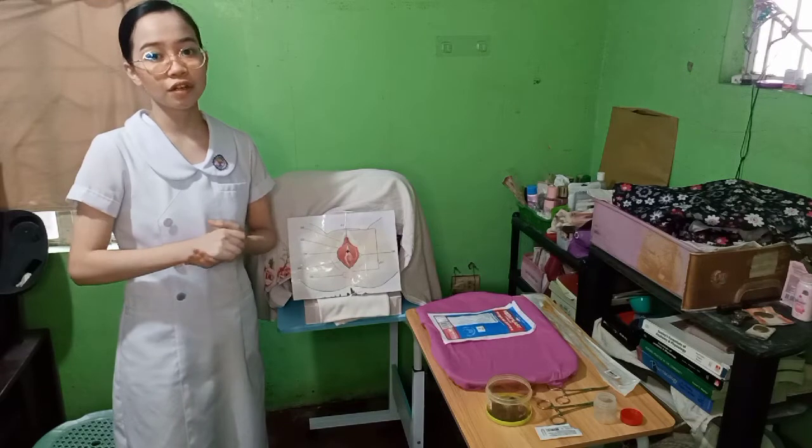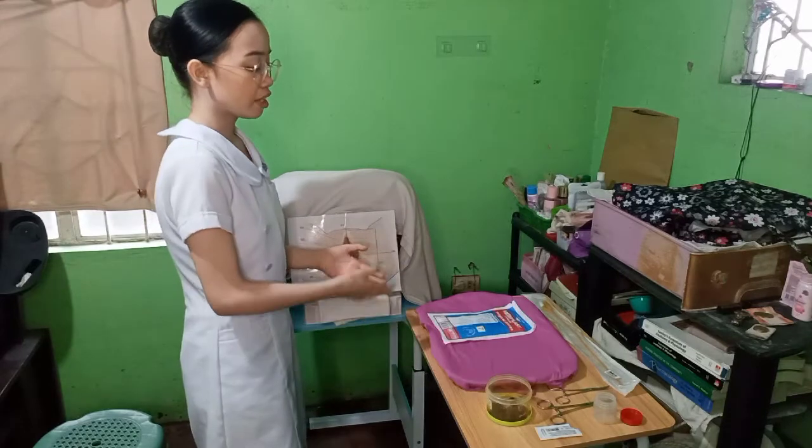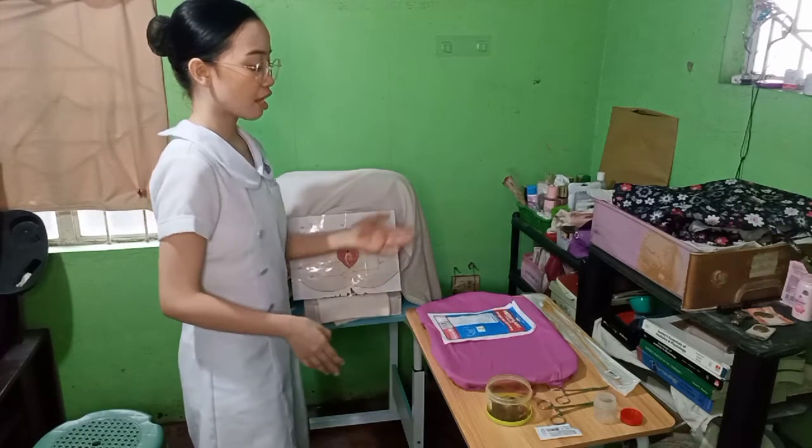And then wash your hands to prevent spread of infection, and it facilitates or prepares us for gloving. And then prepare sterile tray within reach, and it contains the sterile gloves.